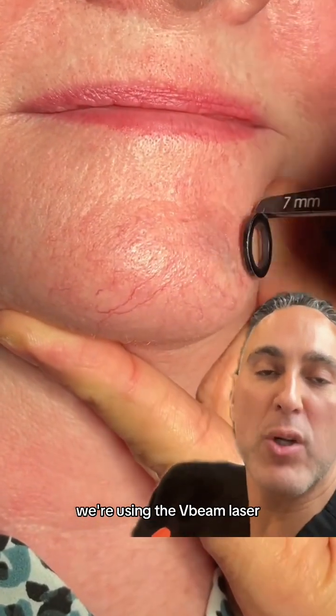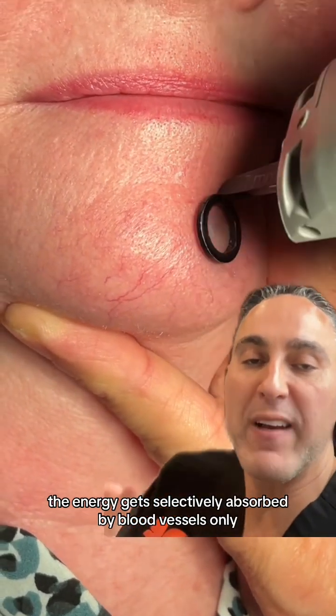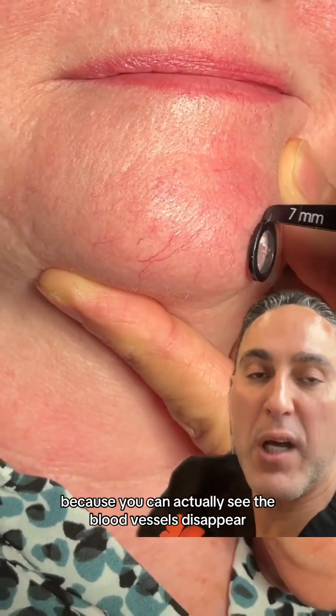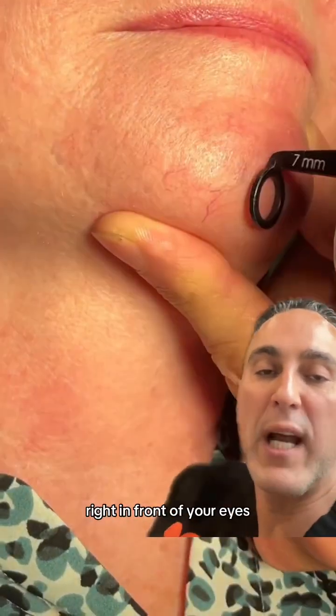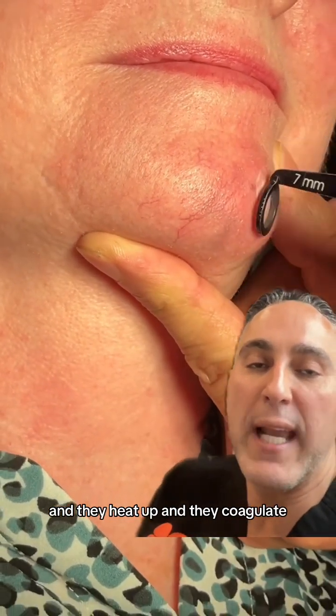We're using the V-beam laser. The V-beam laser is a vascular laser — the energy gets selectively absorbed by blood vessels only. This is a really cool video because you can actually see the blood vessels disappear right in front of your eyes as they absorb the laser energy, heat up, and coagulate.